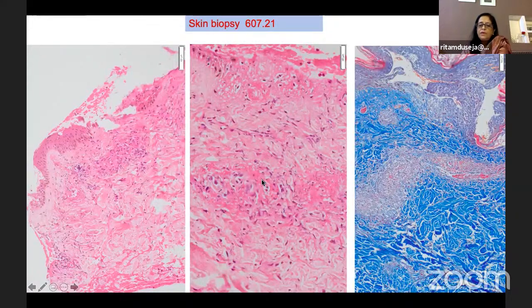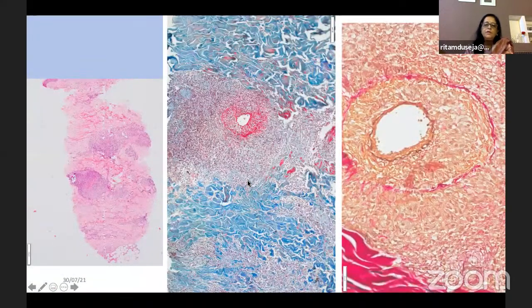But we cannot and we should not try to give a diagnosis of small, medium, or large vessel vasculitis based on skin biopsy, because as you know, the vessel size seen in skin could be involving a medium size vessel in a different organ also. So we just label our biopsies as having arteritis, to correlate with serology and other clinical features.